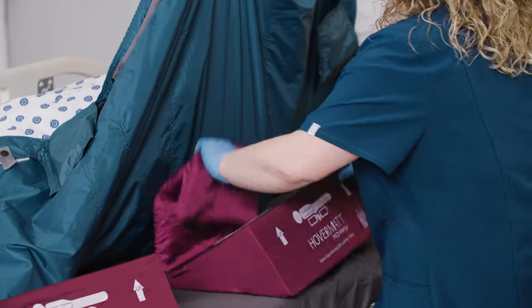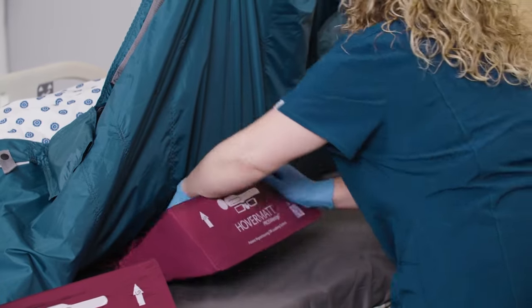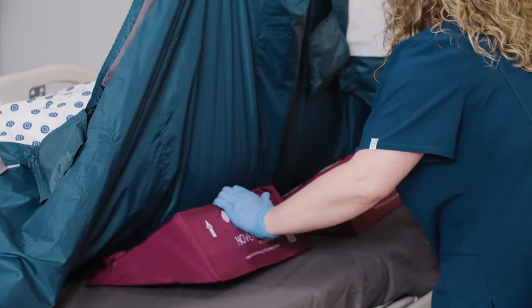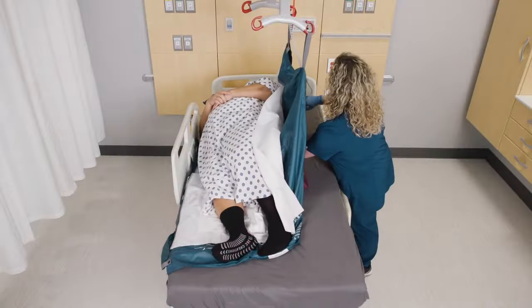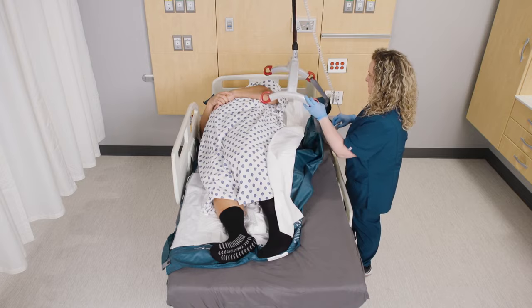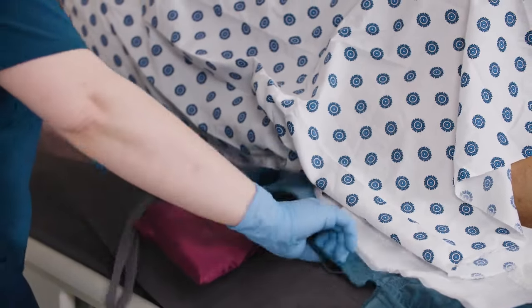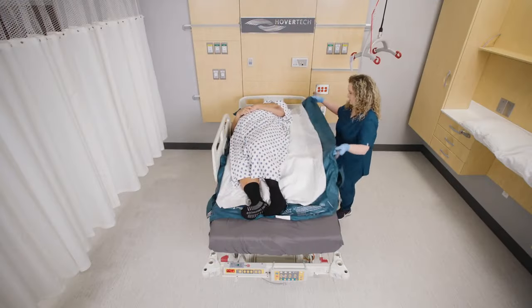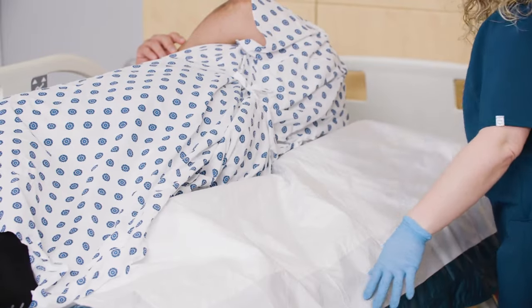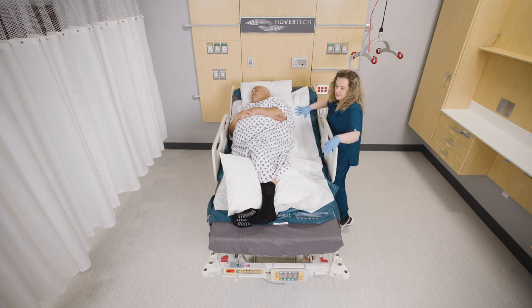Locate the sacrum and insert the tail of the wedge just under the patient's thighs. Place the standard wedge to support the patient's back about one hand's width away from the tailed wedge. After the wedges are placed, lower the patient onto the wedges. Ensure the straps are not underneath the Pro's AIR. Pull the tail through to the patient's other side until taut. Check wedge placement by placing your hand between the wedges, confirming the sacrum is not touching the bed. If it is, reposition the wedges to ensure sacral offloading. Raise the head of the bed and side rails or follow your facility's protocol.